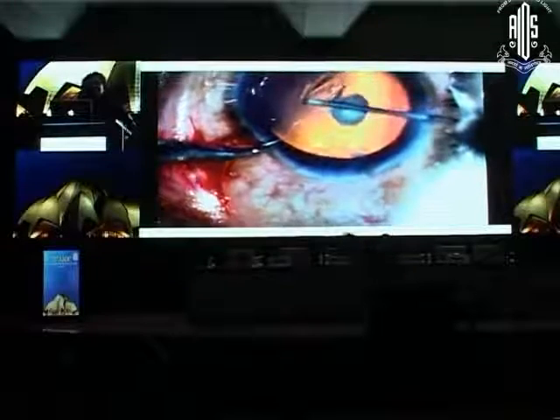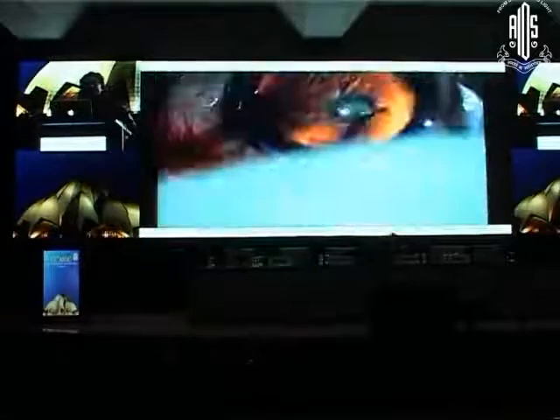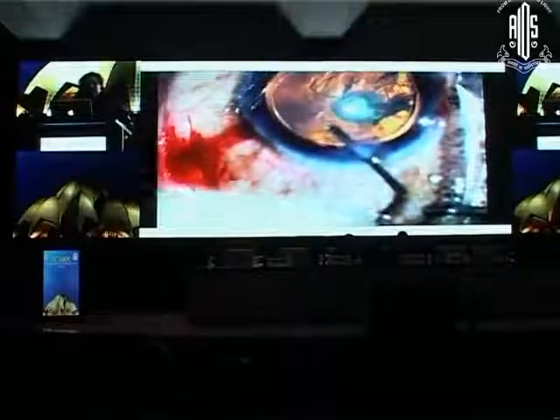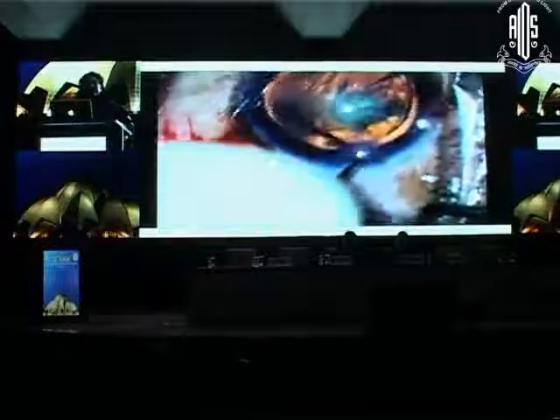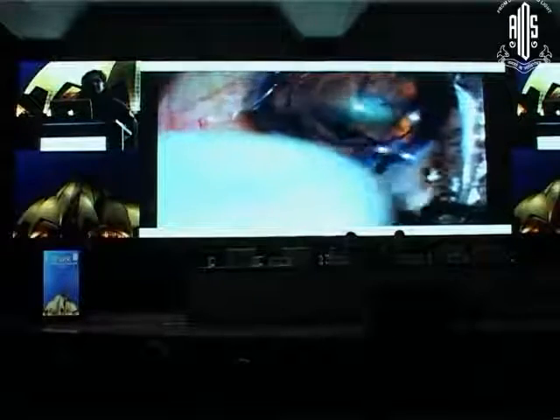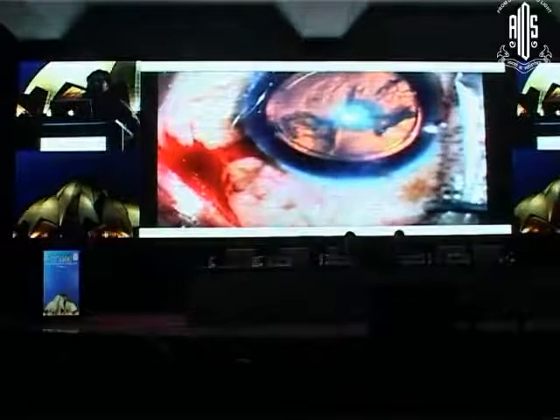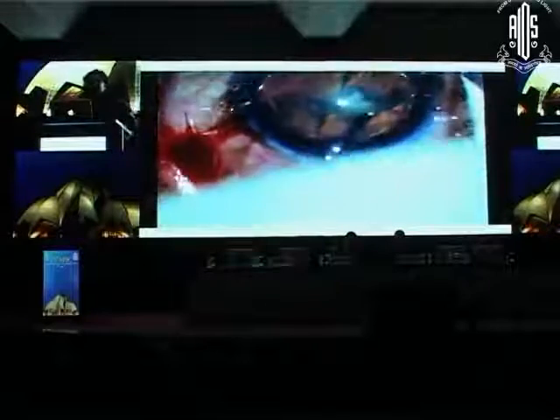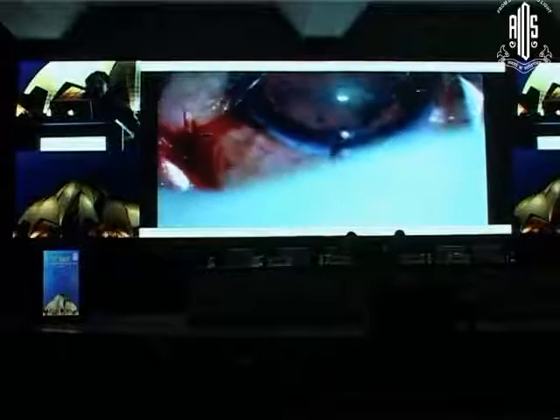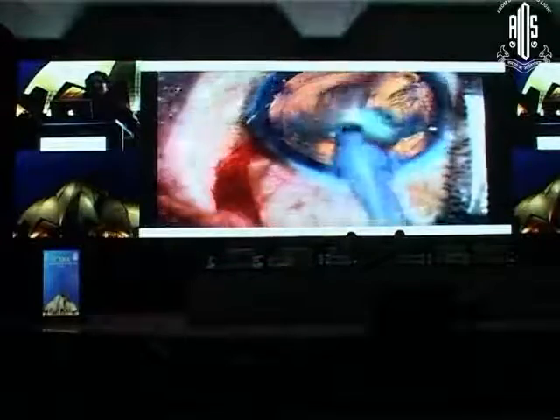In these types of cataracts, there might be a pre-existing rent, so a standby system for vitrectomy is necessary. So you do a careful hydro procedure. As you can see here, you can see the formation of a golden ring. The golden ring suggests that you have a complete separation of the nucleus by the hydro procedure that you have already performed. This procedure helps to separate the nucleus, but we are doing it carefully in this patient because if there is a pre-existing rent, then it can expand.